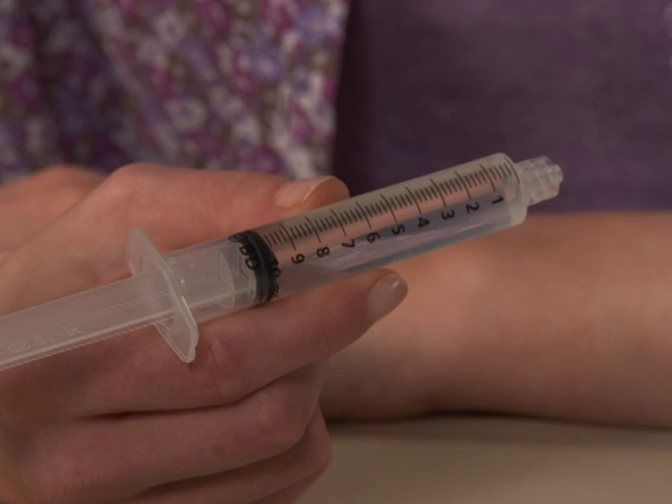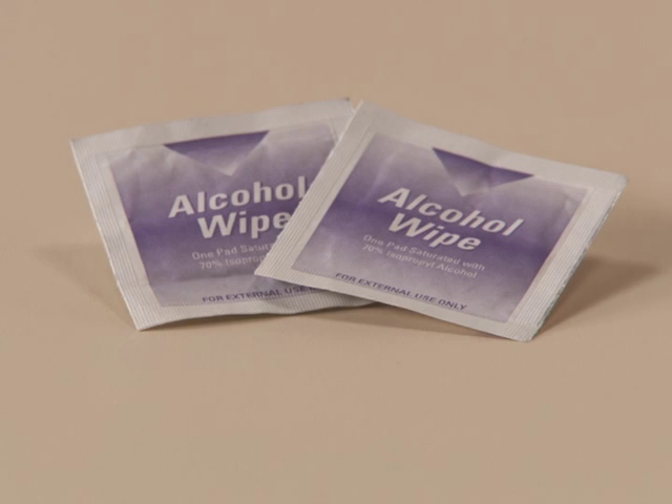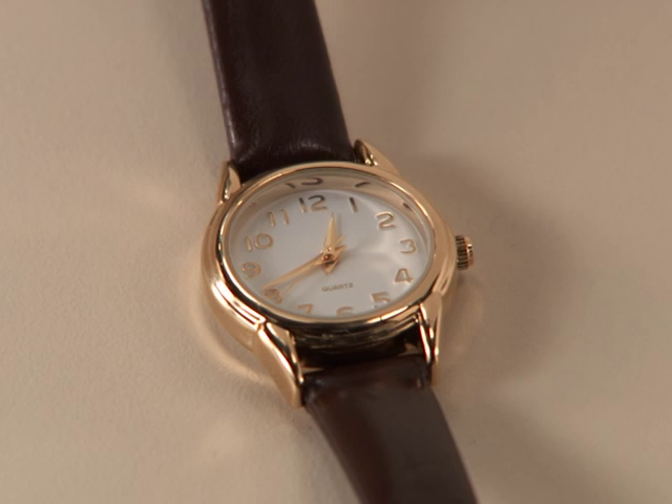Supplies needed: dissolved Synrise in 10 mL syringe; infusion set with winged adapter, also known as butterfly needle with tubing; tourniquet; alcohol prep pads; sharps container; medical tape; bandages; and a watch.